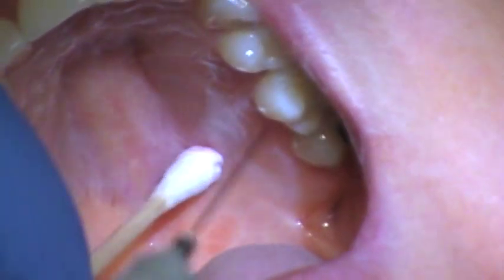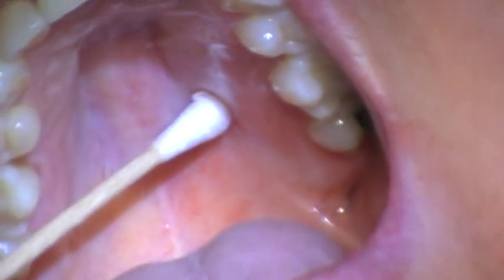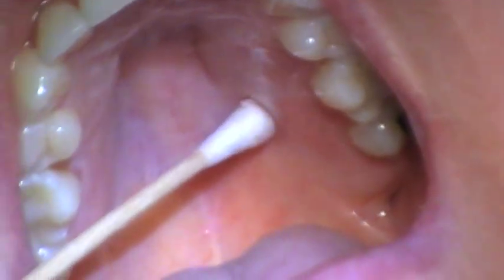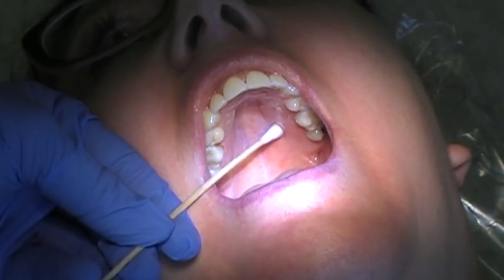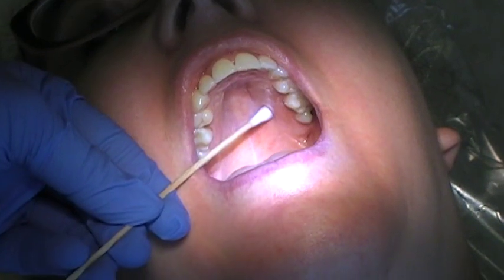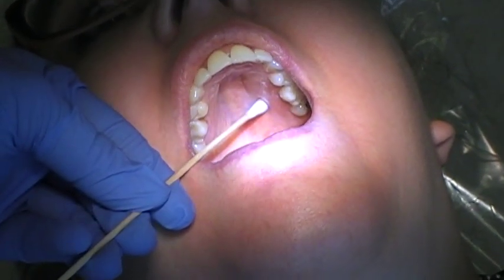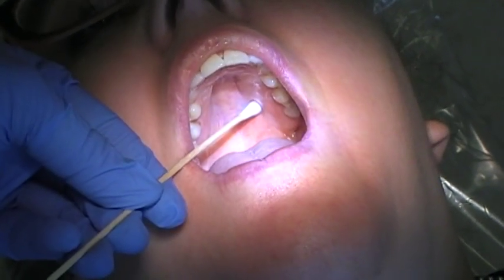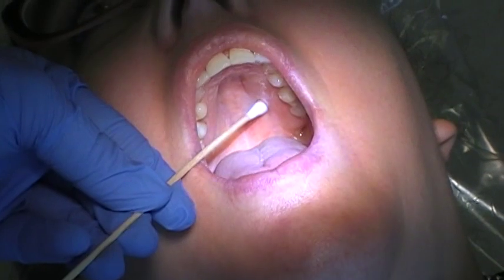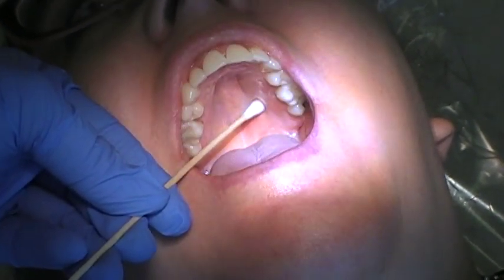I like to go in with my thumb on top and go straight into the site, holding that pressure there for at least one minute — two minutes is even better. Normally I would have topical on this q-tip, but for visibility I didn't put it on. She did have topical earlier, and I'm going to watch the clock — you need to do this for at least one minute.